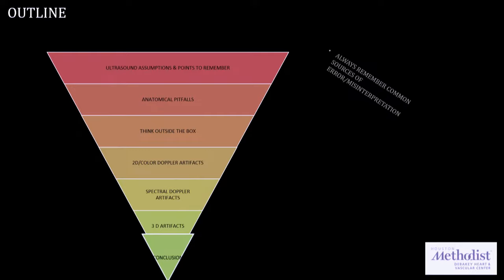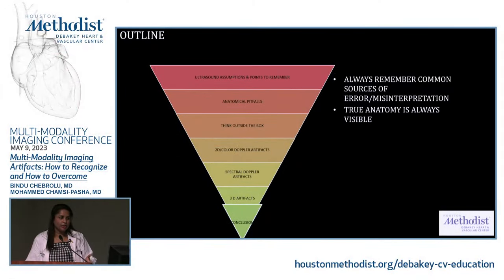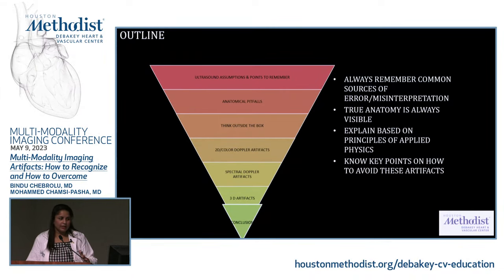All right, guys, I think so. Always remember common sources of error and misinterpretation. True anatomy is always visible in multiple views. Explain based on the principles of applied physics. And know key points on how to avoid these. Important when you're acquiring these images.